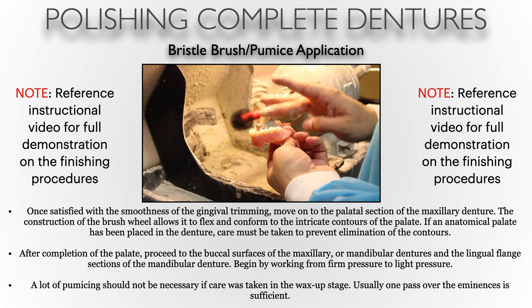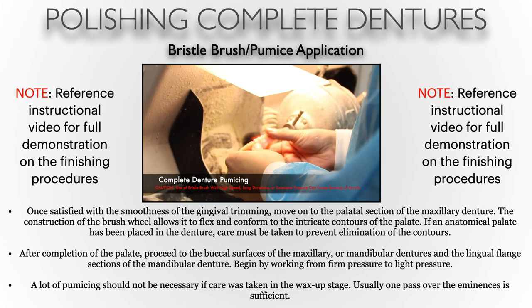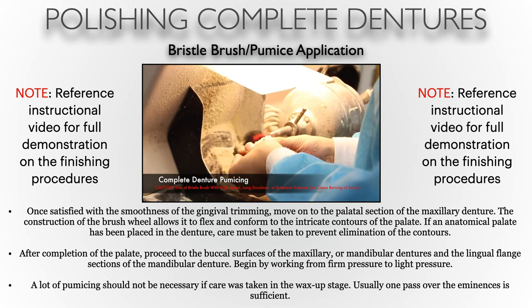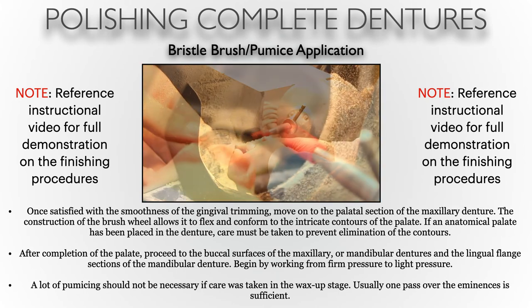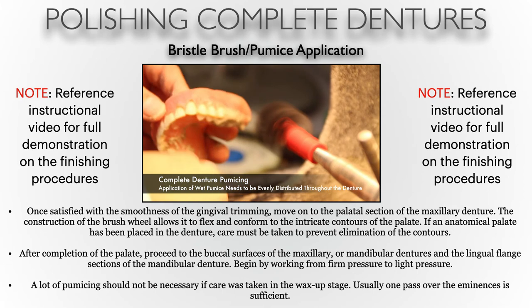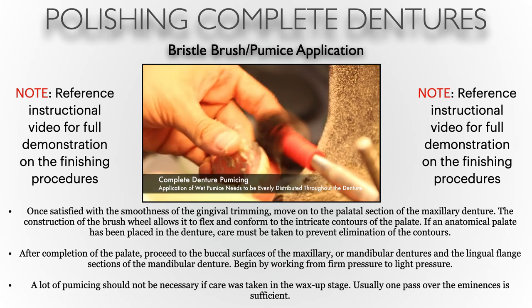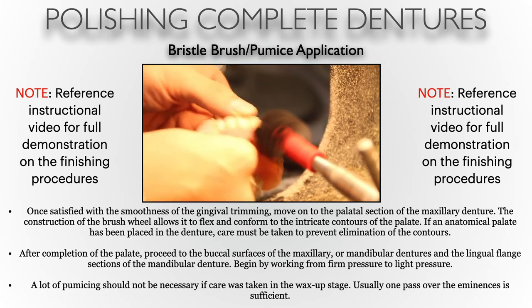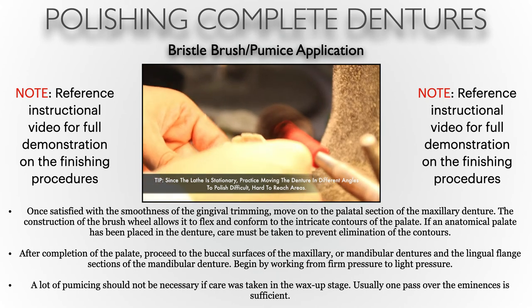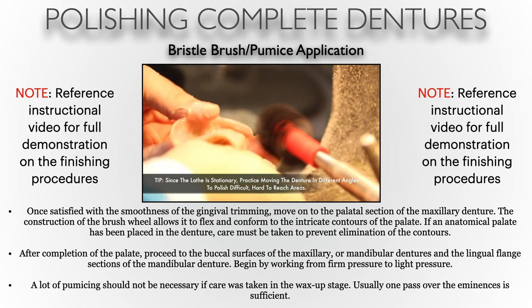Once satisfied with the smoothness and gingival trimming, move on to the palatal section of the maxillary denture. The bristle brush wheel is cone-shaped to aid in reaching hard-to-reach areas like the palate. After completing pumicing of the palate and surfaces, you can move to the buccal surface of the maxillary and the lingual flanges of the mandibular. A lot of pumicing should not be necessary if care was taken in the wax up and finishing stages. If there are many burr cuts and pumice does not seem to be helping, take the denture back and finish those contours with a rubber wheel or a finer carbide bur.